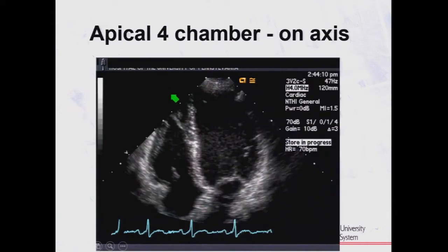This is the standard 4-chamber view in the same patient, and you can see that the RV looked dilated but is completely normal in size. And so when we talk about RV measurements, we have to be sure whether we're doing RV dedicated or whether we're doing standard 4-chamber.